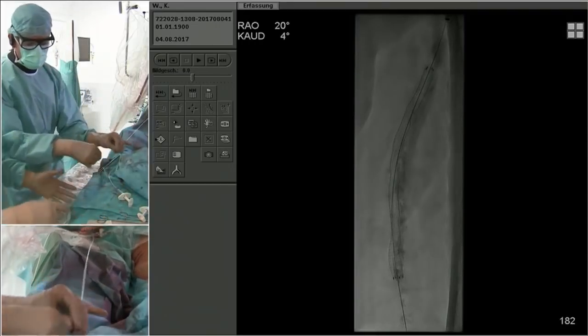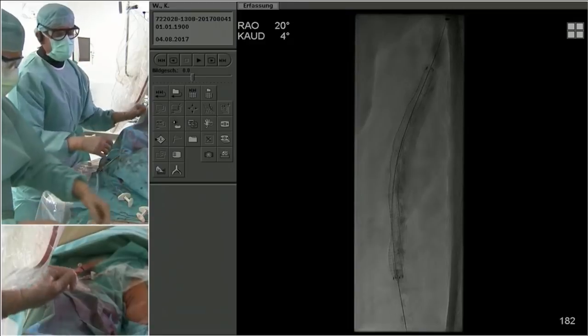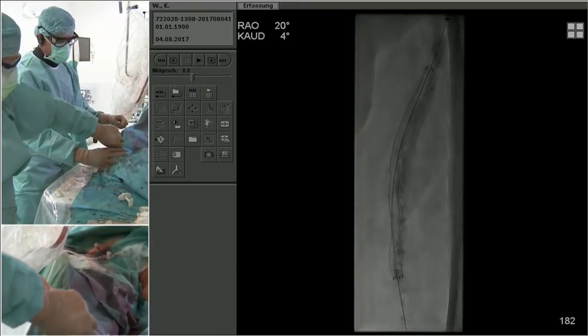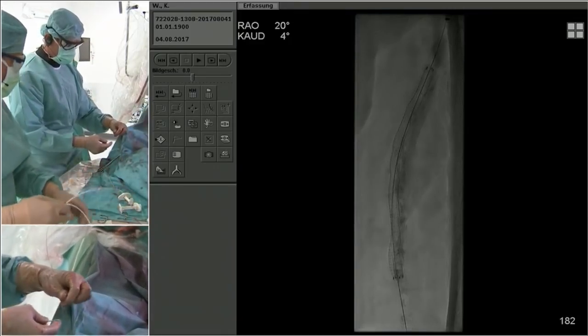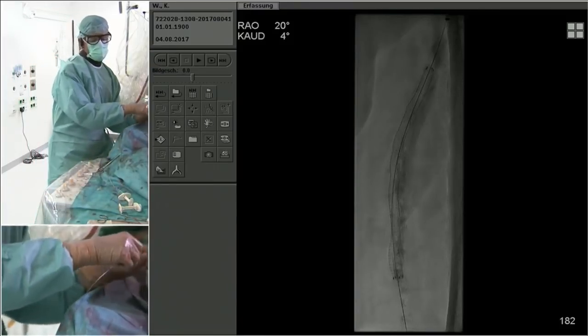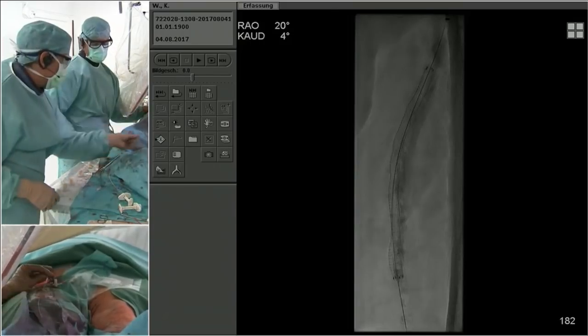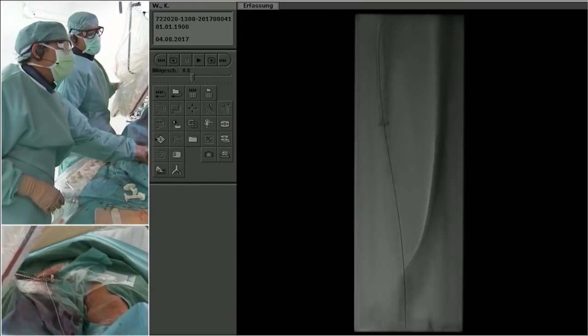So let's take the 7. Which wire is he working on? Balloon in. 18. Over. And of course, if it looks good, I mean, then we have again the question: is the Supera still necessary?